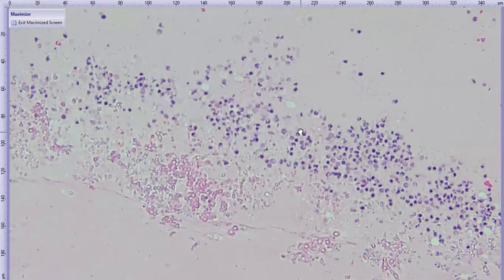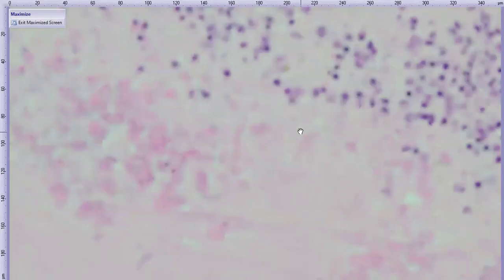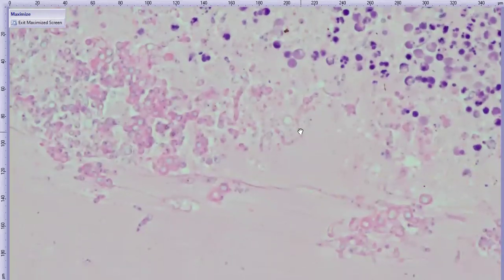Ah, yeah. Or like a pseudohypha to be. Some of them look like they had little nuclei or something. Yeah, okay. It's a pseudohypha in potentia. Yeah, that's right. I sounded fancy there if I didn't trip over the word slightly.